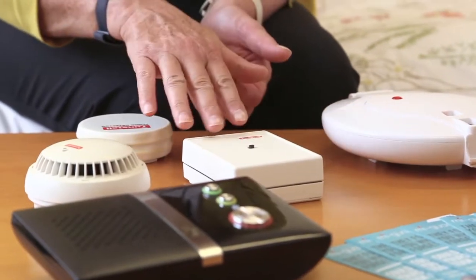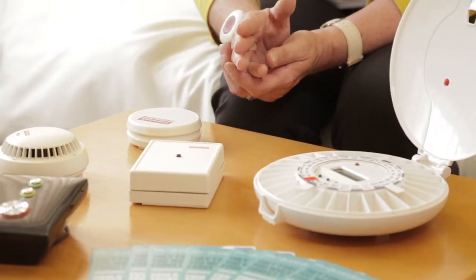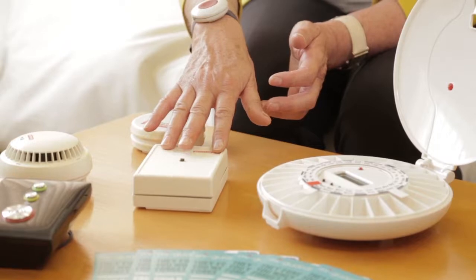This is an example of a temperature extreme sensor. It might go outside the kitchen or even over the cooker, so that if someone leaves a pan on and the heat is building up, the heat detector will pick that up and will send an alert. It could equally be placed low down in a lounge where someone sits. So if the temperature drops within the room to a dangerous level where someone might suffer with hypothermia, it would pick that up.